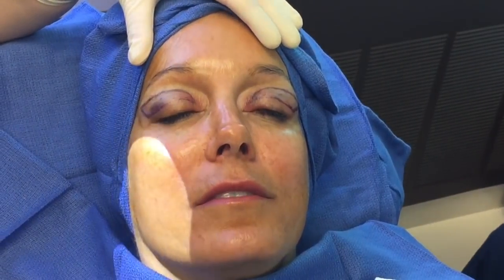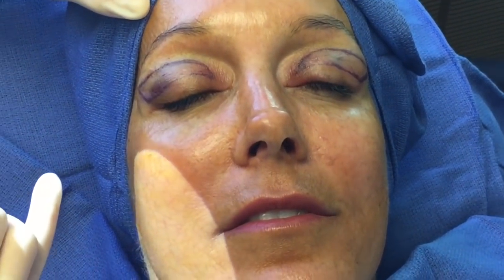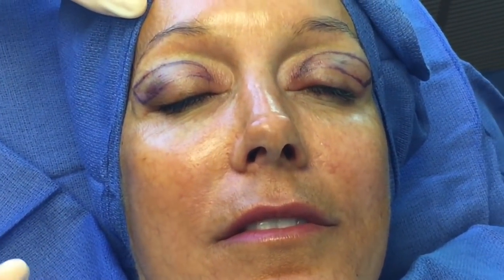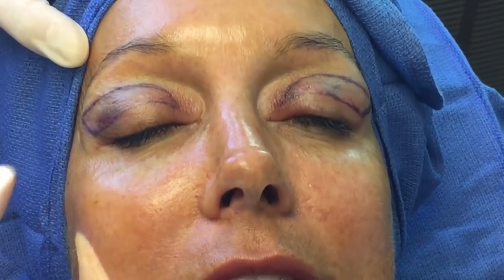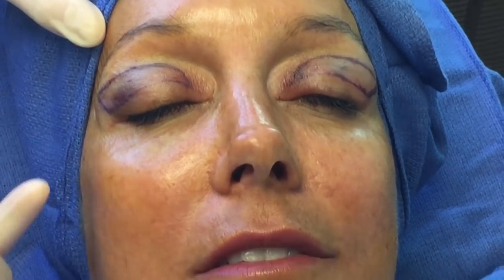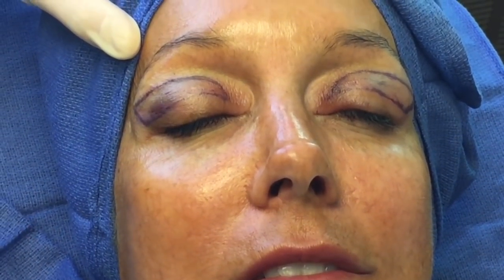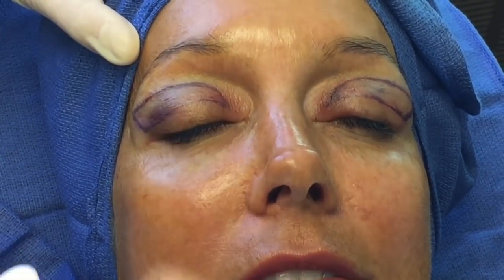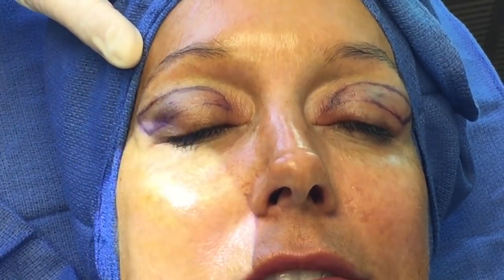Our patient is all ready now — prepped, draped, and ready to get started. I've already injected both eyelids with lidocaine with epinephrine, which ensures everything feels completely numb and also helps with bleeding so there's very little bleeding during the procedure. Patients won't feel a thing after the injection. I do a lot of these in the office, and usually when I'm just doing the upper eyelids I do it under local.